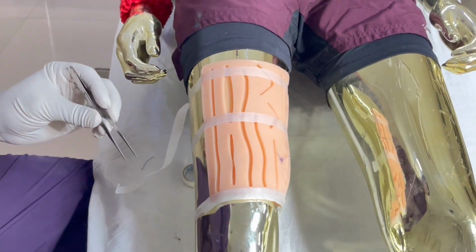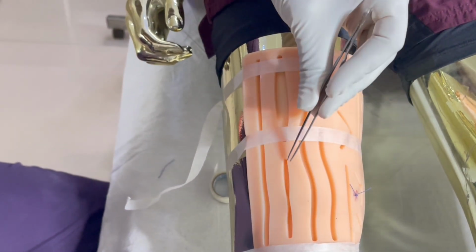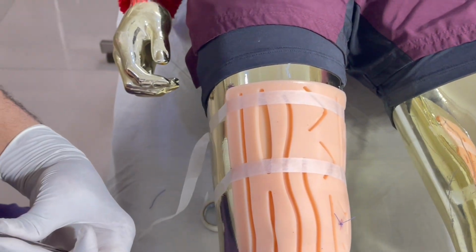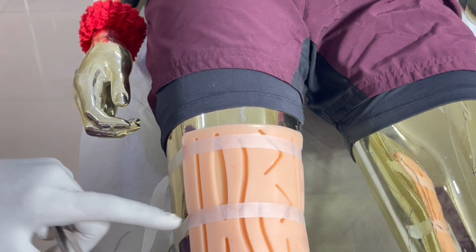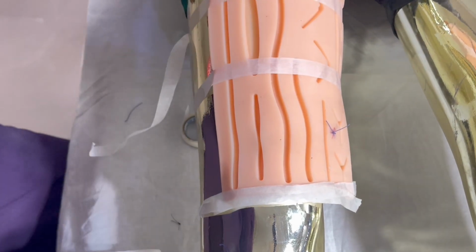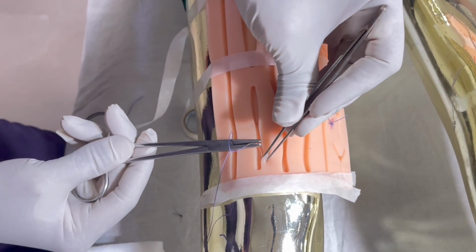So the next station, among the stems, was the suturing skill about the subcuticular. This is the wound where I have to take a subcuticular stitch. First of all, the starting end is this, and this is the finishing end. It will be done in this manner. The first stitch will be taken in this manner.